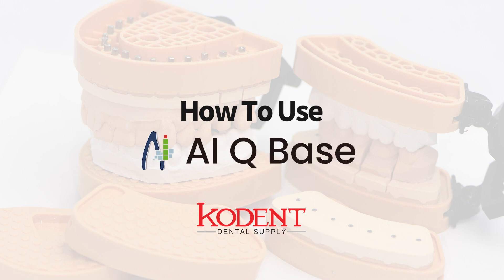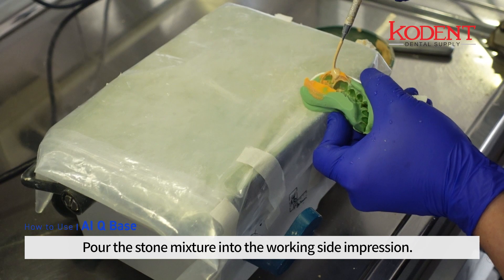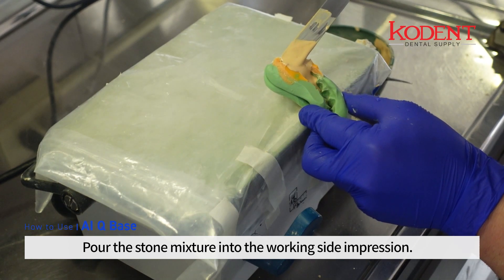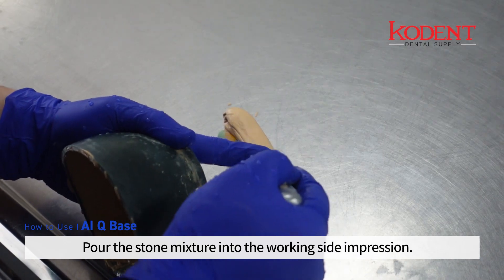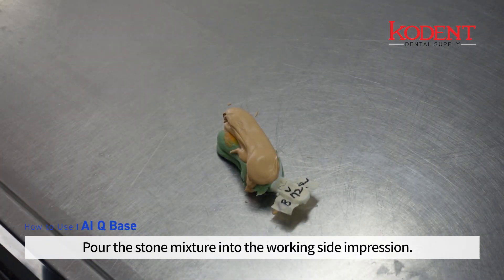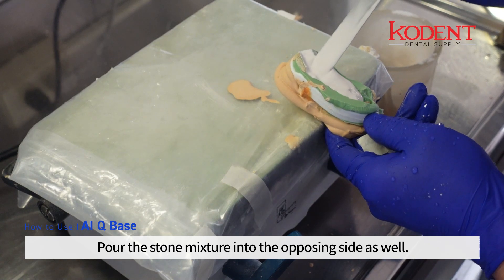How to use an AIQ base: pour the stone mixture into the working side impression, then pour the stone mixture into the opposing side as well.